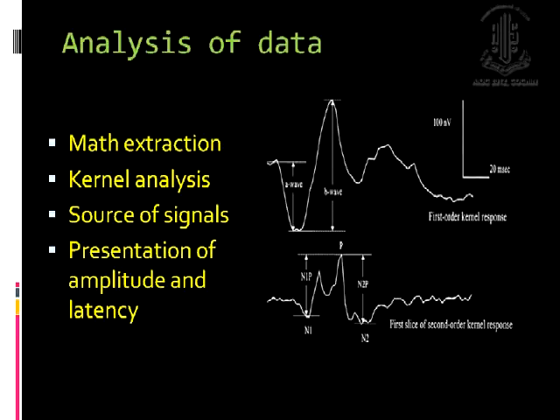Basically, the origin of the signal is coming from the cone responses. That's the main focus, because this is a very high luminance and very high contrast stimulus, so it's actually targeting your cone response. There is very little contribution from the inner retina and the ganglion cell. Some people say there's none. Unless you modify the contrast and the luminance, then you can get some contribution.